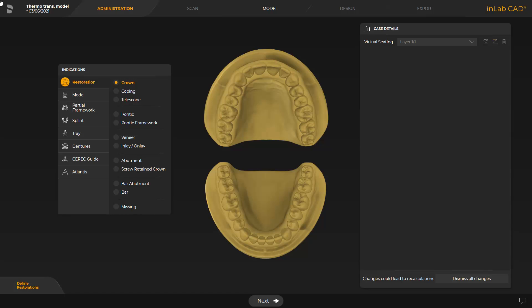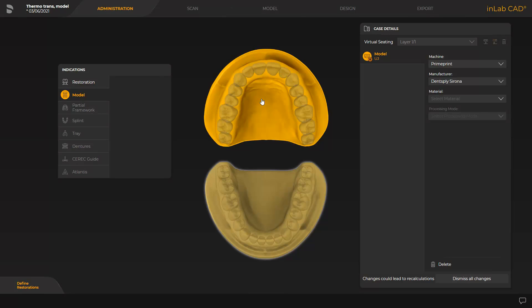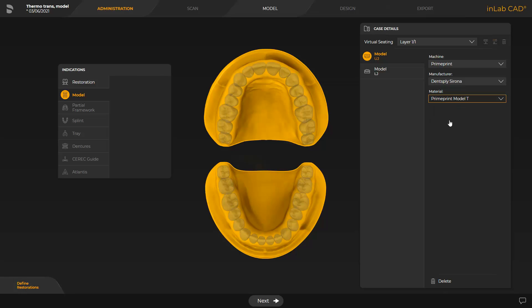To create a thermoforming model, we first switch to the model indication. We tap both the upper and lower jaw and determine the material for creating thermoforming models in the Case Details window. We repeat this process for the upper jaw and switch to the next phase, the model phase.